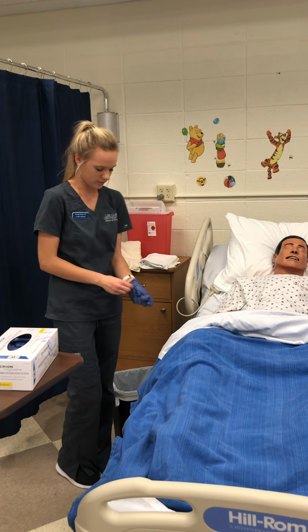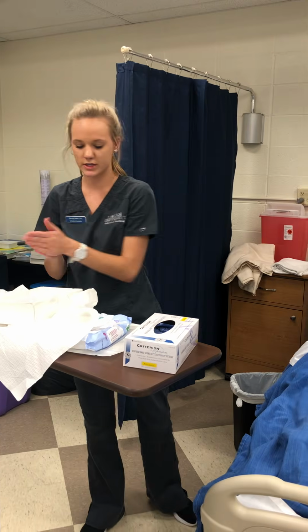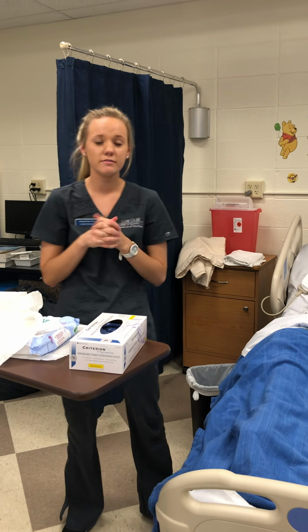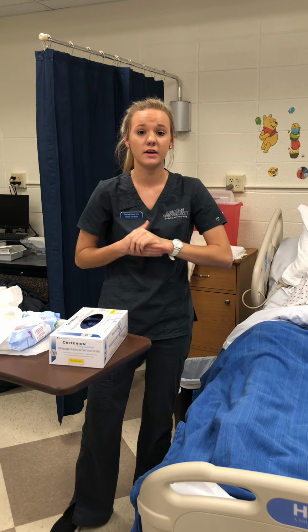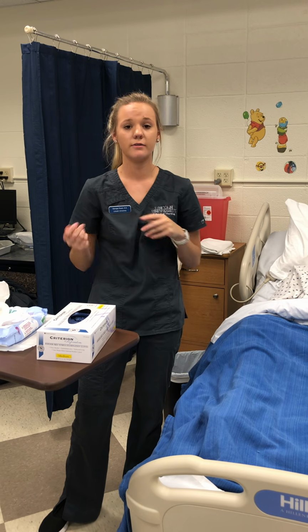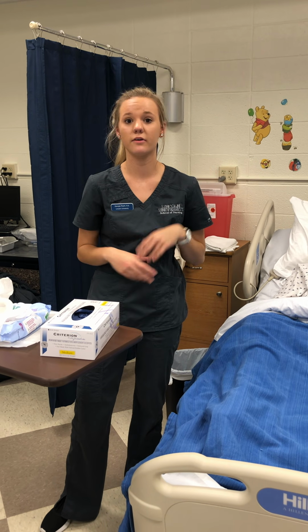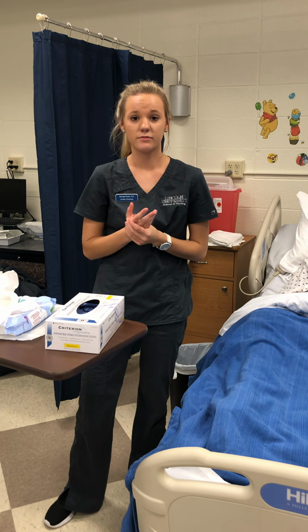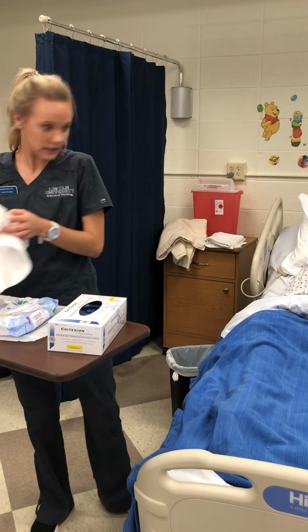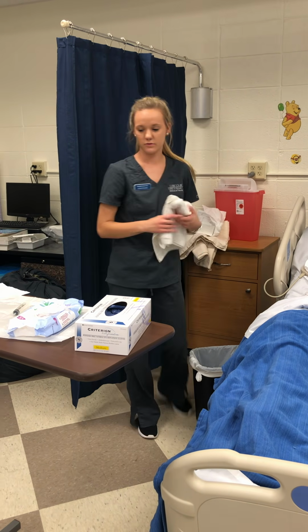Okay. I would make sure I clean up my mess before I leave the room, perform hand hygiene, and then I would go out and document the time and date of insertion, the size of the catheter inserted, how my patient tolerated it, and he tolerated it well. Then I would also document the characteristics, the amount, color, and smell, or any other findings of the urine. So this would all be cleaned. Clean up the room.